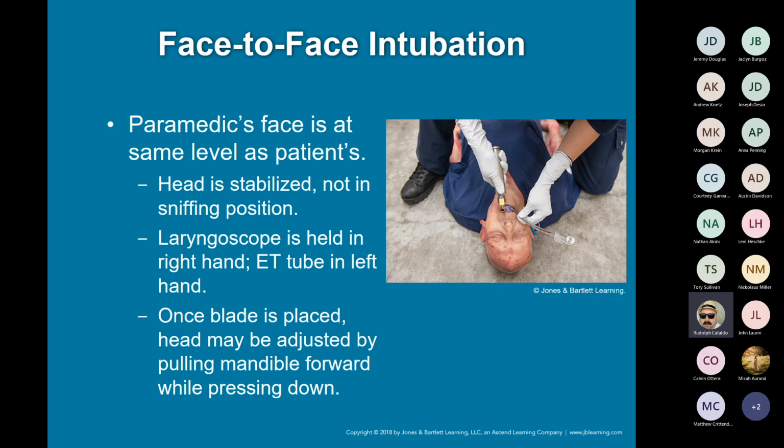You can do it like you see here, with just a laryngoscope and a blade. But again, at that point, it's blind insertion unless you're able to look down their trachea somehow, maybe get above them, whatever it might be. But in these instances, especially with trauma, we're trying to still maintain that stabilized position, that C-spine level. So it's kind of a catch-22. You can't manipulate a whole lot or you're going to affect C-spine, but at the same point, it's almost impossible to intubate like that without manipulating it.